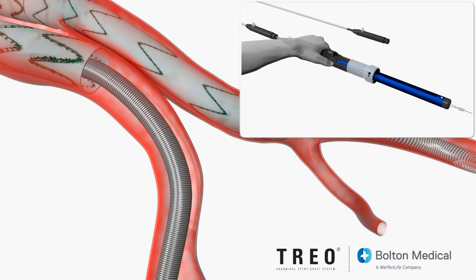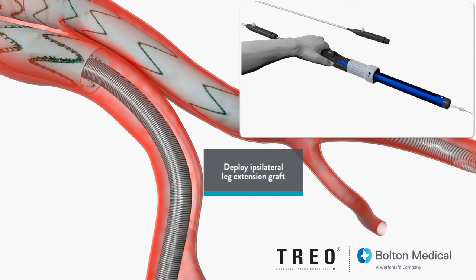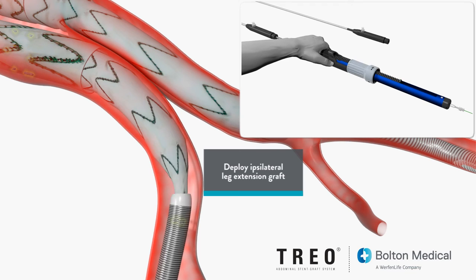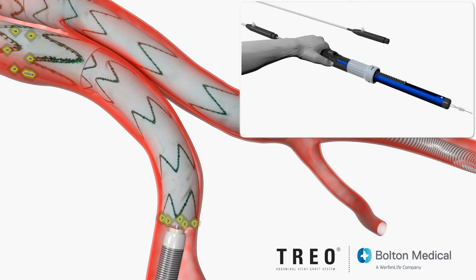To deploy the leg extension stent graft, hold the stationary grip and rotate the turn knob in the direction of the arrow to start initial deployment of the leg extension stent graft. Observe the proximal end of the stent graft as it starts to deploy to ensure the markers are within the overlap zone.